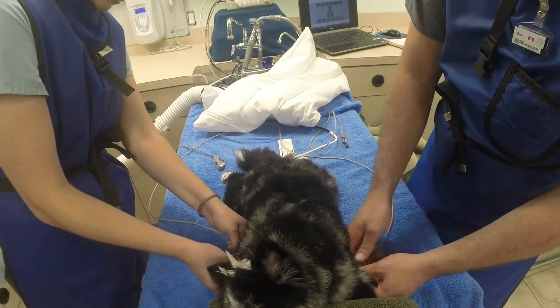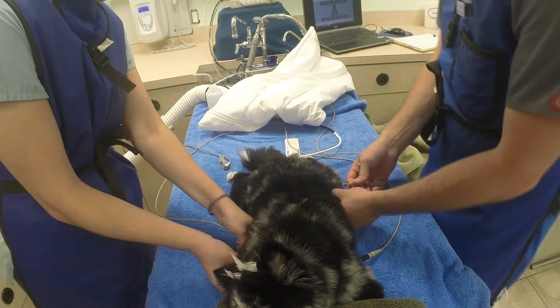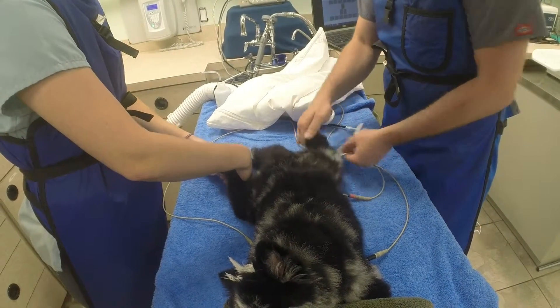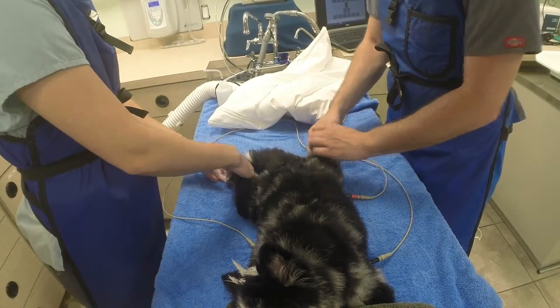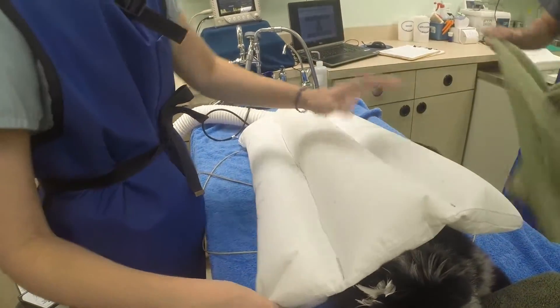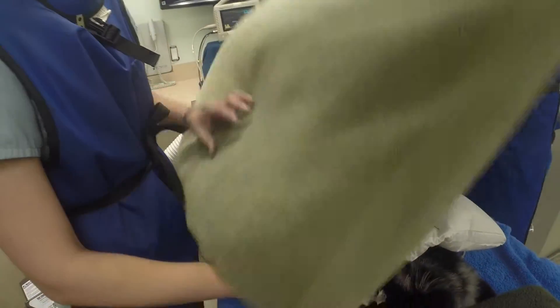ECG leads are attached to allow us to monitor the heart rate, and a blood pressure cuff is applied to monitor blood pressure. We also monitor core body temperature and apply a bear hugger. The bear hugger blows warm air on the animal to keep them warm during the anesthetic procedure.